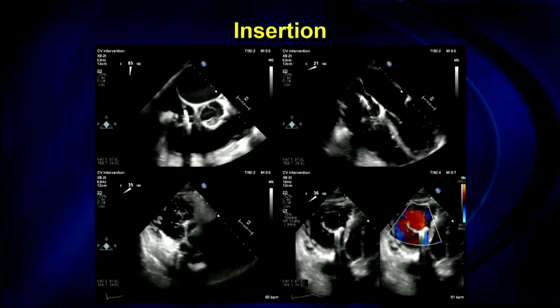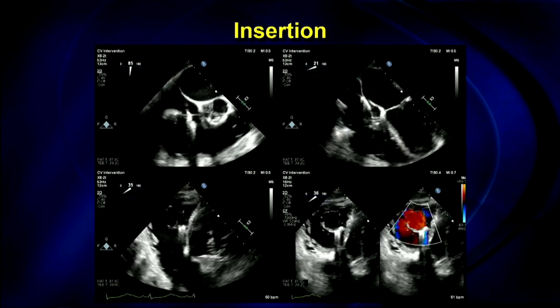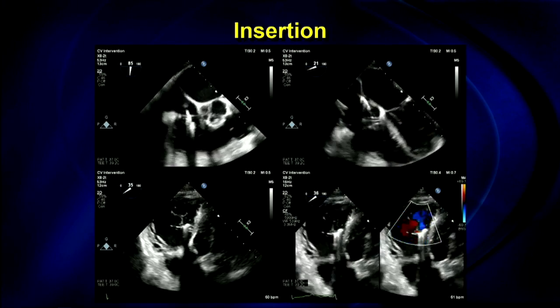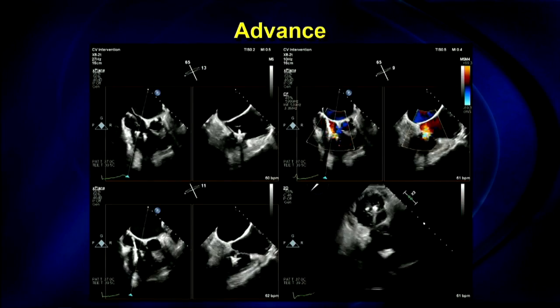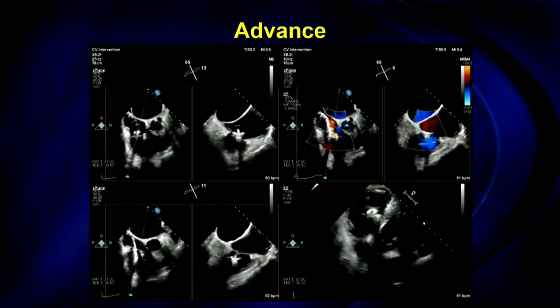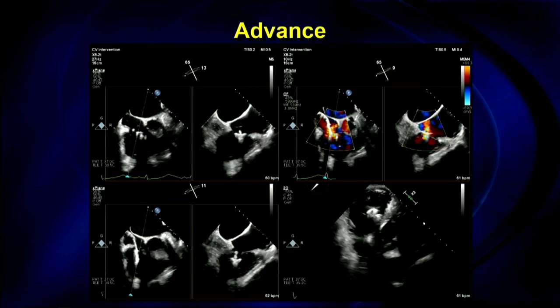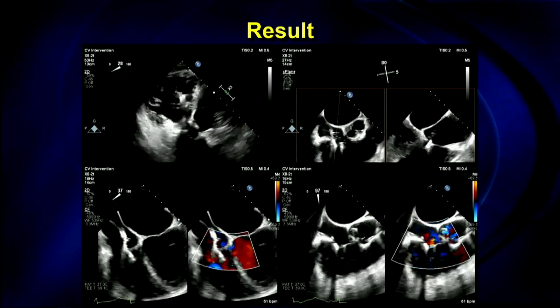And here you can see, again, with this short axis view, that we have a nice tissue bridge just anterior to the cleft. And the residual tricuspid regurgitation is just posterior to that. And then we put our second clip in, and you can get a nice view of the clip arm alignment, just posterior to that first clip. And then as we close, we get a nice tissue bridge.